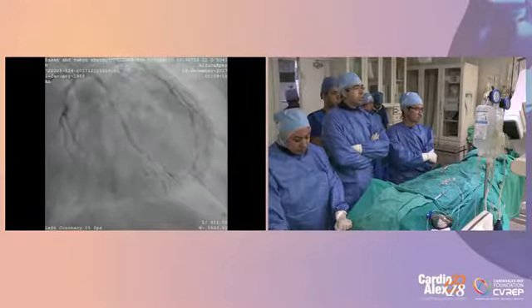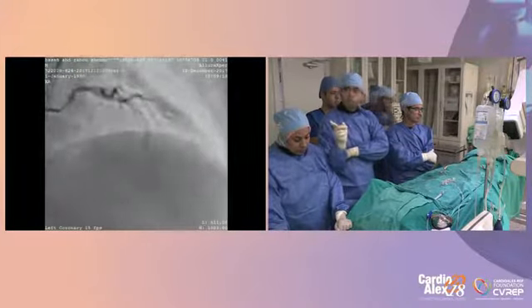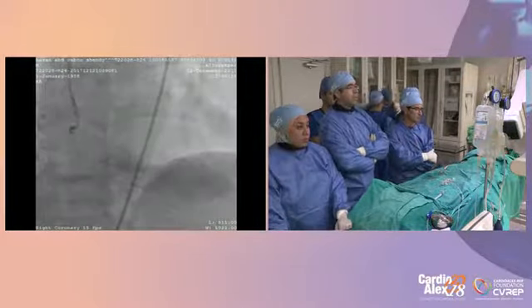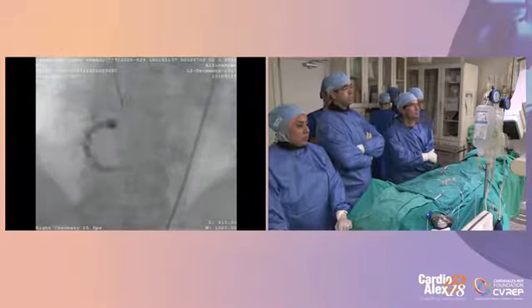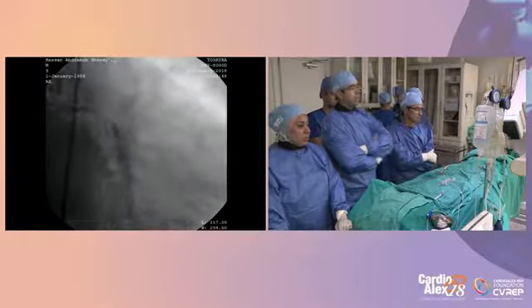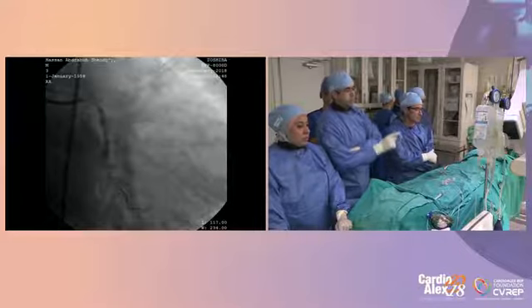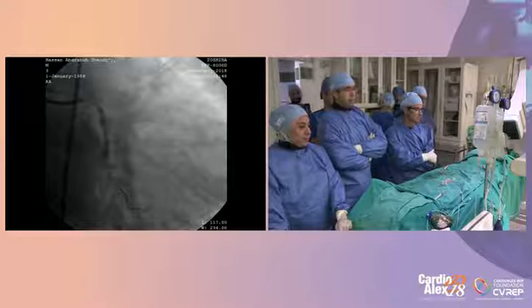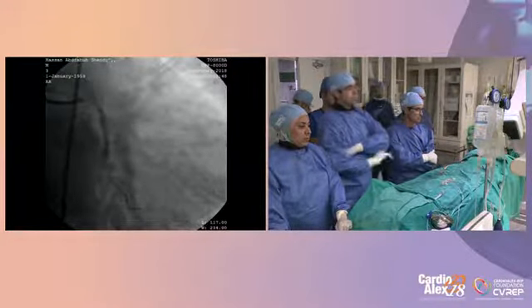This is a coronary angiography that was done 6 months ago. It showed a tight lesion in the circumflex and a long calcific lesion in the LAD, and the right coronary was normal. PCI for the left circumflex was done using a DES 3.5 by 24 millimeter.